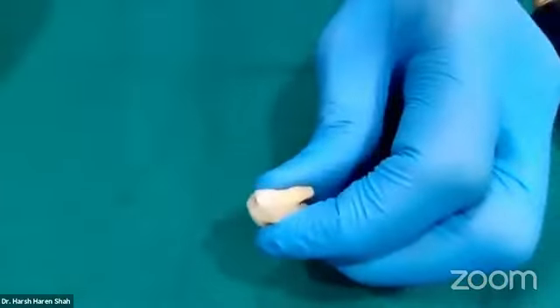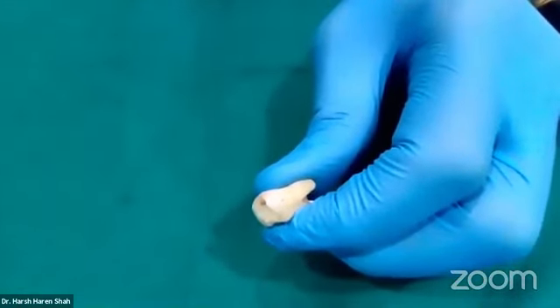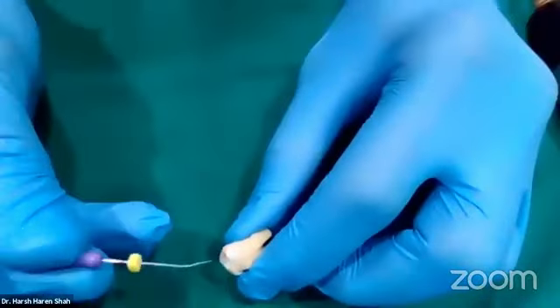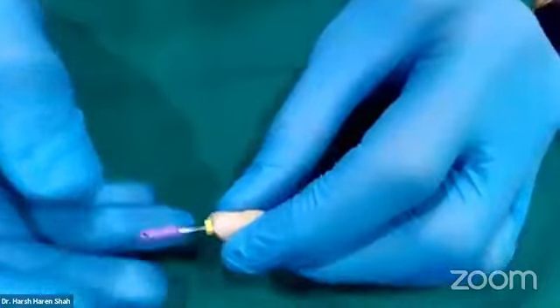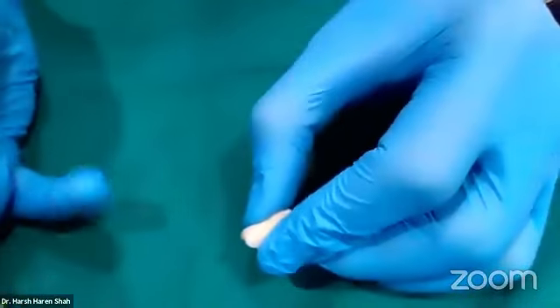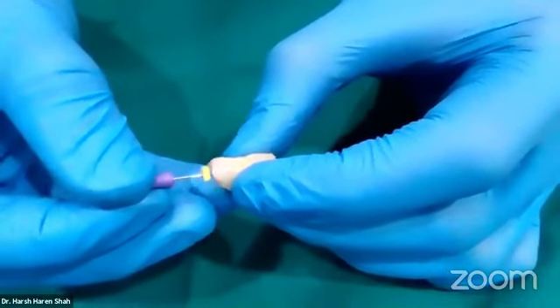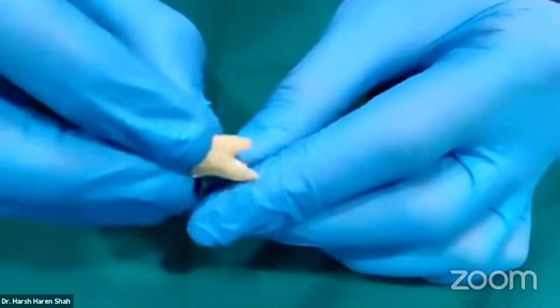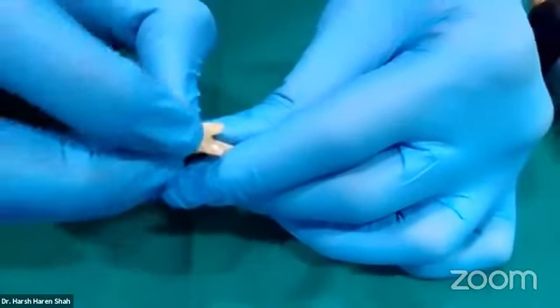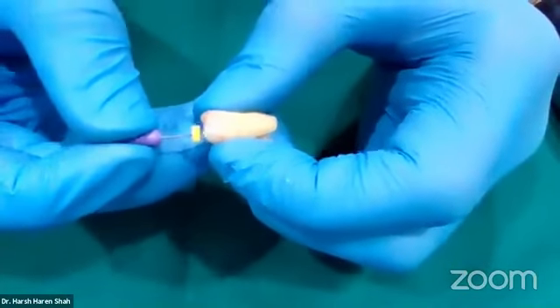At this stage, I will choose to irrigate one more time. I will recapitulate with a 10 number K file and I'll irrigate with sodium hypochlorite one more time. At this stage, I will take the 10 number K file and I'll check. Does it go very, very easily right up till the complete working length? Yes, it does. In fact, I don't know if you can appreciate, it also goes about 0.5 millimeter beyond the apex. So I have good apical patency and I have a good glide path.